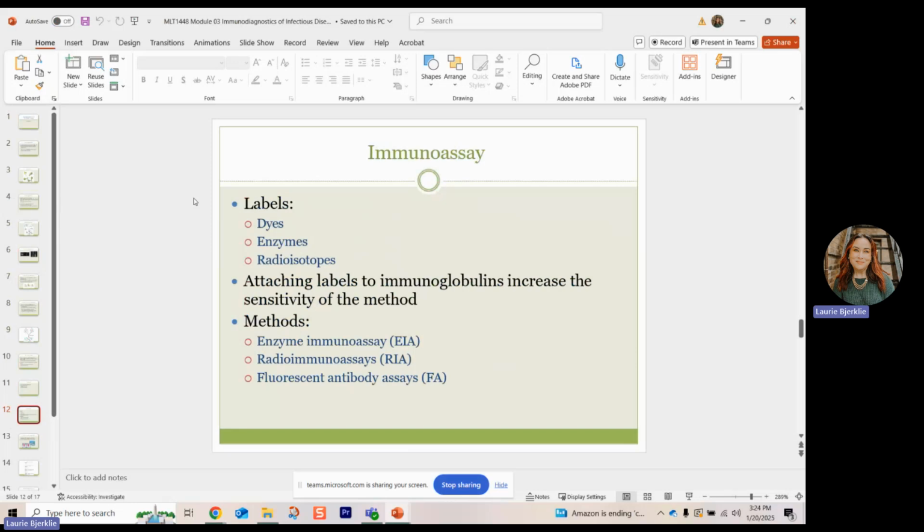You will hear the term immunoassay quite a bit, especially in certain parts of chemistry. Immunology is one of those areas that's spread throughout the lab, because you have different immunology methodology happening in most of the lab. An immunoassay is just a test that involves antibodies. Anytime I see the word immuno in the title of something, I know an antibody is most likely involved.